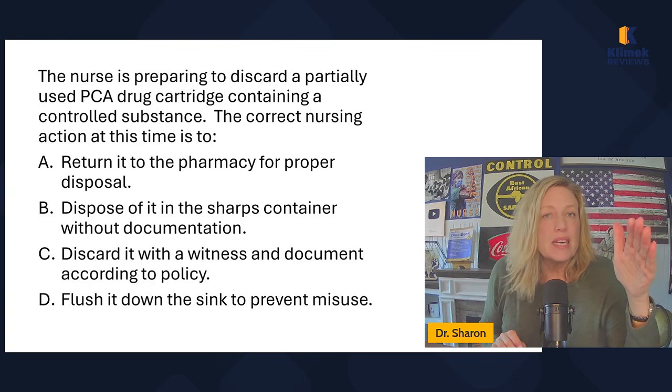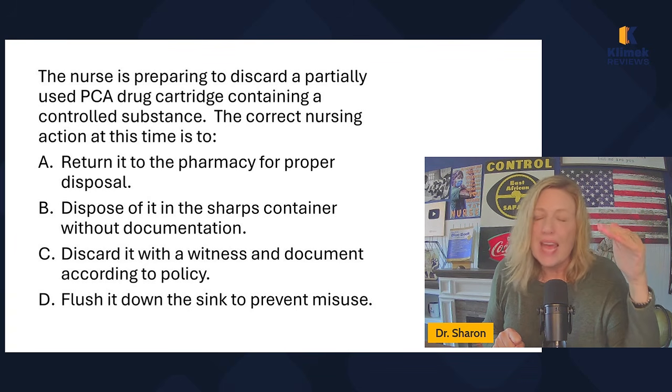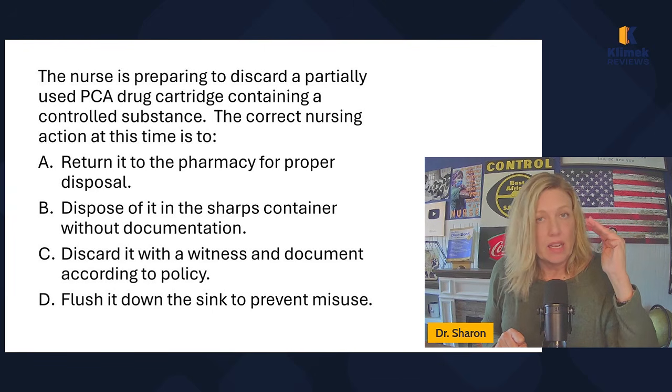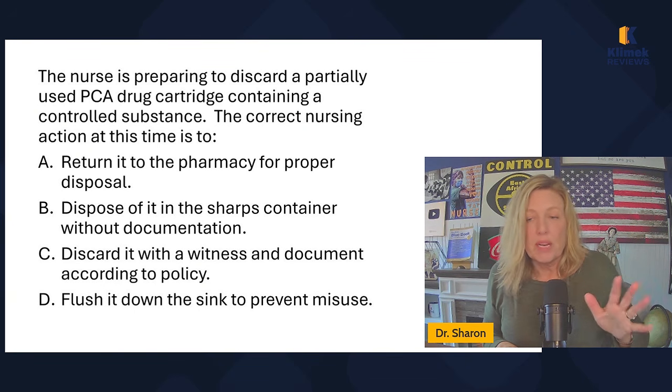And y'all, I'm telling you, in real life, do not ever discard this stuff without a witness, ever. They will come back at you and accuse you of stealing it when you didn't do it. So don't ever discard it without a witness. You have to do it and then document it according to policy.